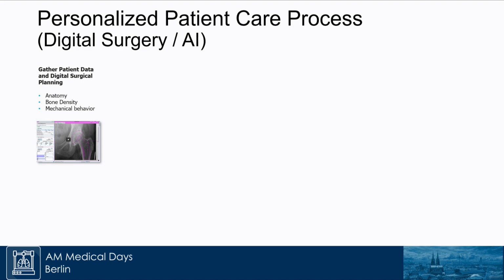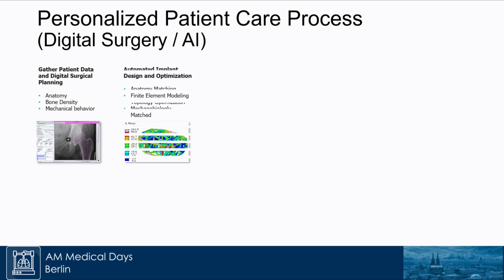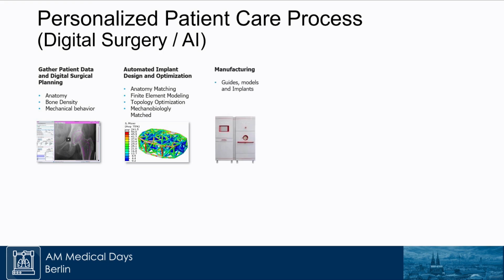That starts with having software which can automate the segmentation, especially for the patient-specific devices. You can plug the images into the software and it will automatically extract the volume. And then you have design software which can optimize your structure, takes into account the bone density and the quality of the bone of the person, and designs a structure to match that. And then we have the manufacturing process. Can we bring some of these machines to the hospital?